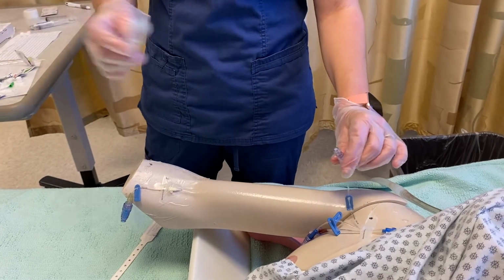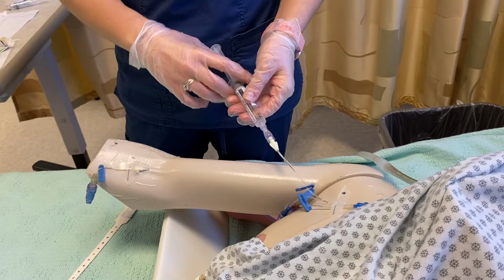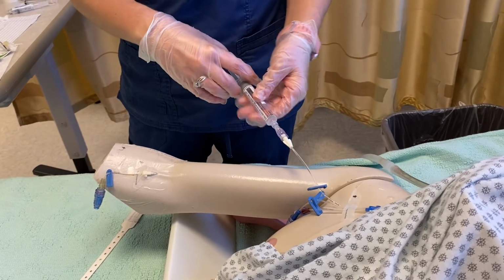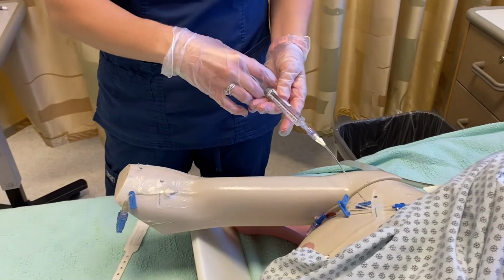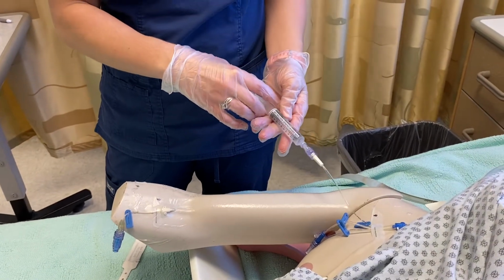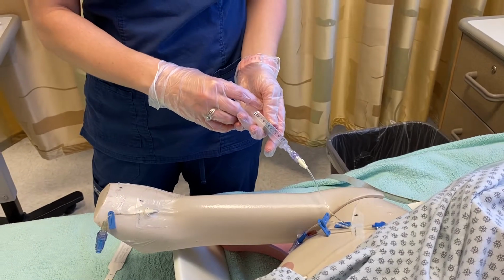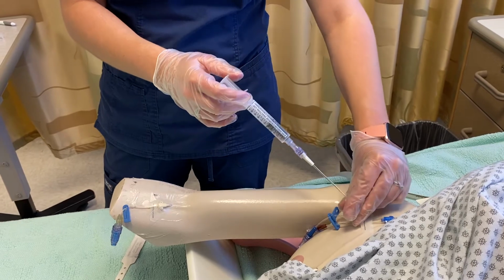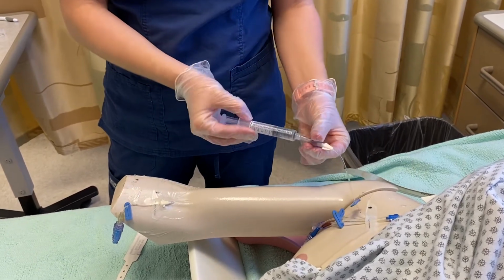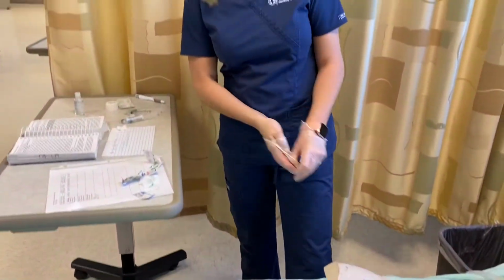Wait for it to dry. We're going to say it's dry. And we're just going to give this slowly as well, just in case there is any meds. First, unclamp it. And just for the amount of solution that your facility calls for. So we'll say we're good. We'll clamp that. We're good. Take my gloves off.